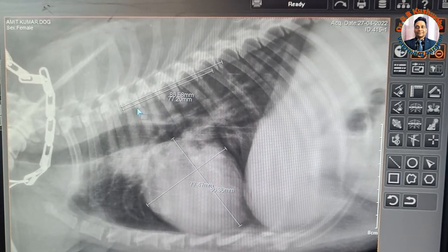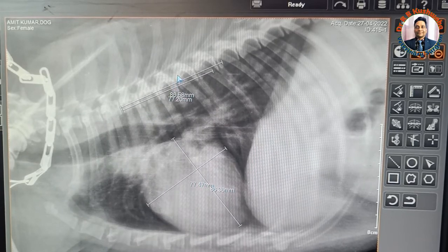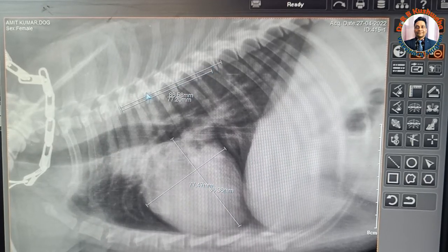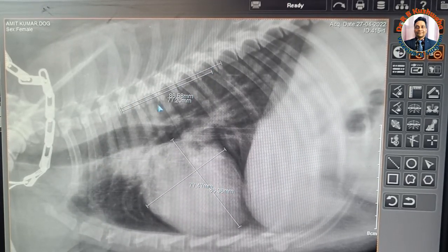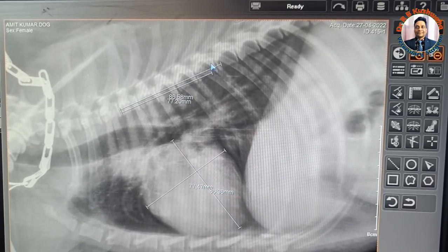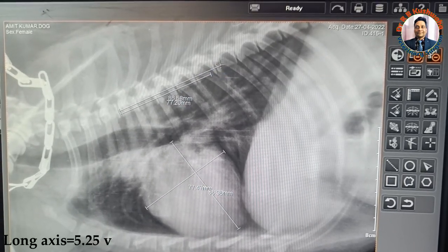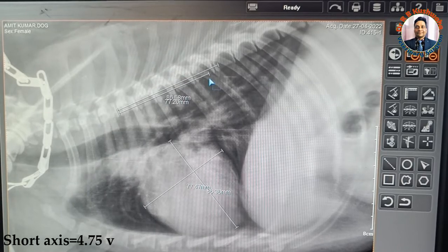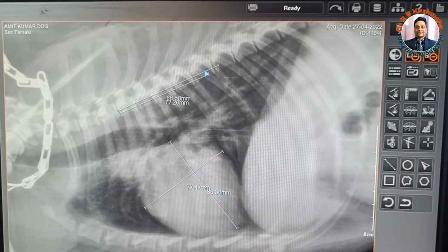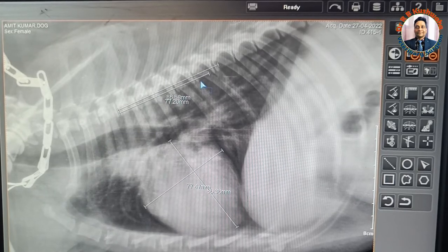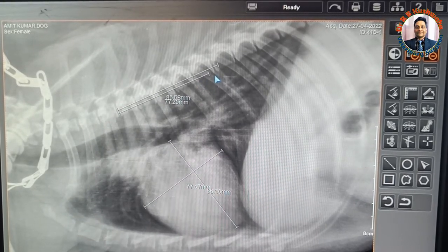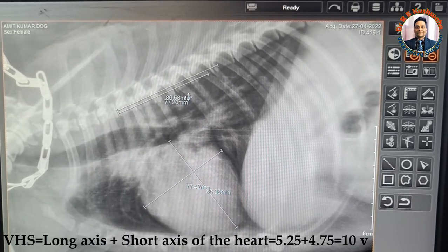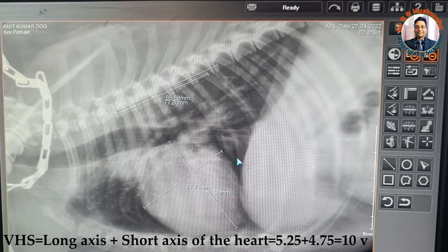Now we count the number of thoracic vertebral bodies occupied by the sum of the short axis and the long axis. Counting for the long axis gives 5.25 vertebrae, and for the short axis, 4.75 vertebrae. So 5.25 plus 4.75 equals 10 — giving a vertebral heart score of 10 V (vertebral units).